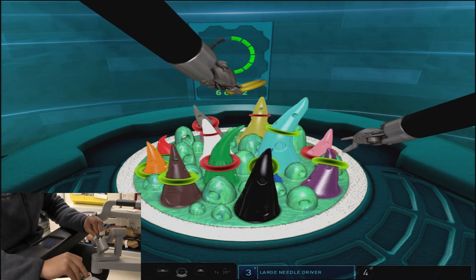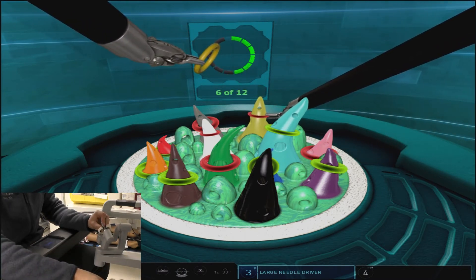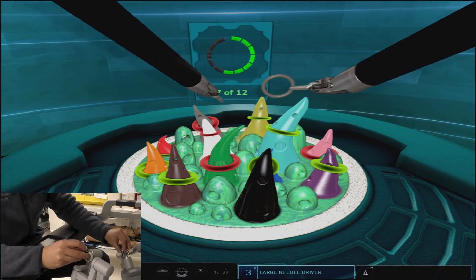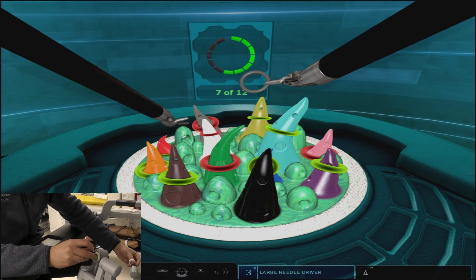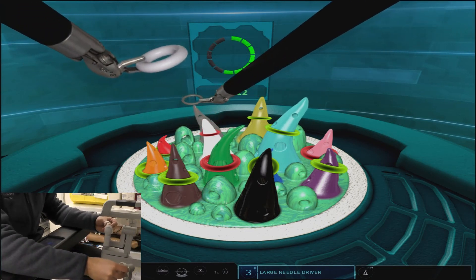It should be noted that cone collisions of any sort require a pretty heavy penalty and can minimize your score, so taking the extra steps to prevent the arm from hitting any unnecessary cones is the best way to score well in this exercise.